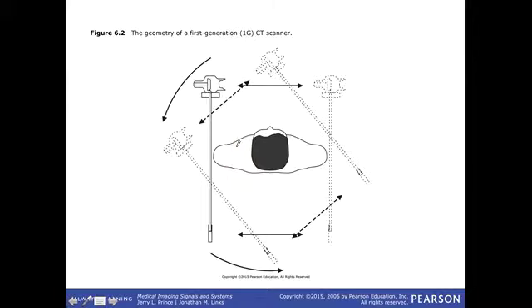And ideally, what fraction of the X-rays do you think we want to have the patient attenuate? Just to take a guess. Do you want it to attenuate 99%, 1%, what? 50%? 30%? Yeah, probably about half, right? Because you want the object you're imaging to essentially be translucent, right? But you don't want all of the damn X-rays to go through it, because then your contrast is just on a small fraction of the X-rays you've shot through there.